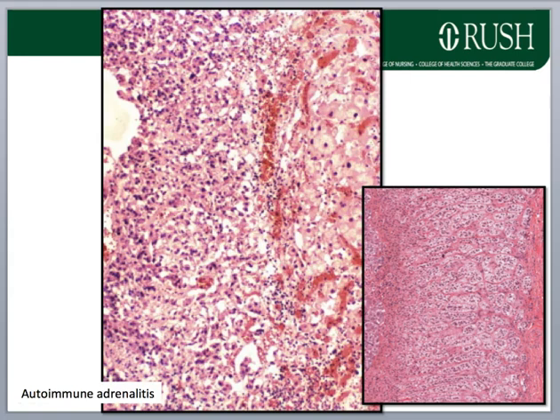Okay, so that's it for the adrenal cortex. I hope that these images and my guide through them helps you reinforce some of the descriptions that you find in the readings and in the study guide. Make sure you look at the figures in the readings. Those are quite helpful too, and there's also some clinical pictures that help reinforce the signs and symptoms that you see in Cushing syndrome and Addison syndrome respectively.